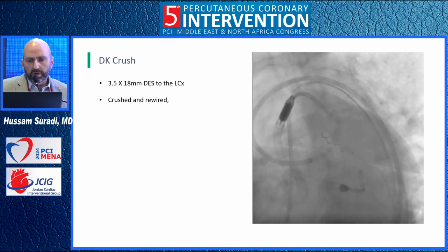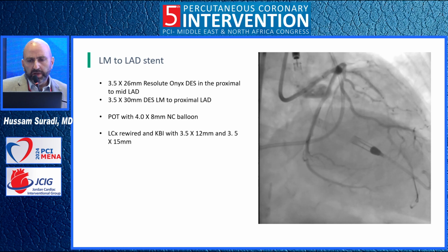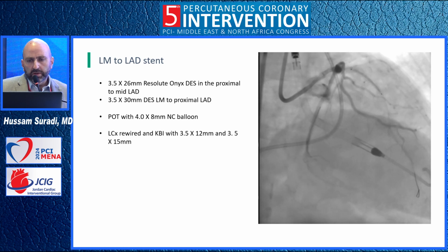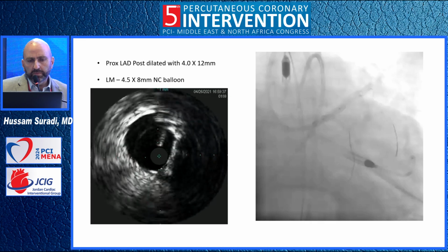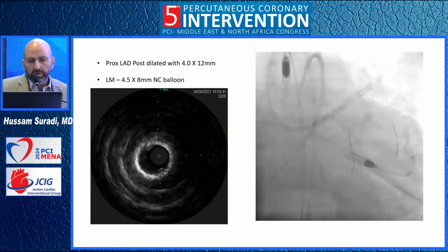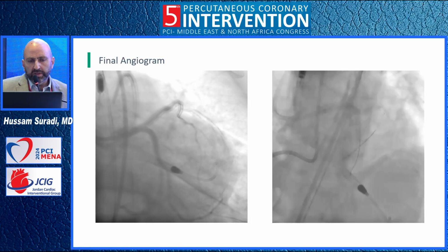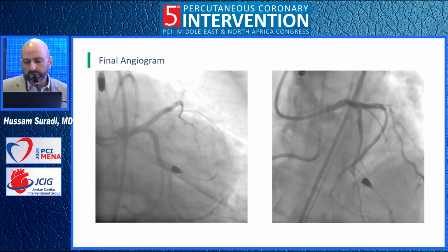So here you see the first kissing balloon inflation, followed by stenting of the LAD, and another stent all the way back to the left main. We did the POT and then a second kissing balloon inflation, and this is the final result.